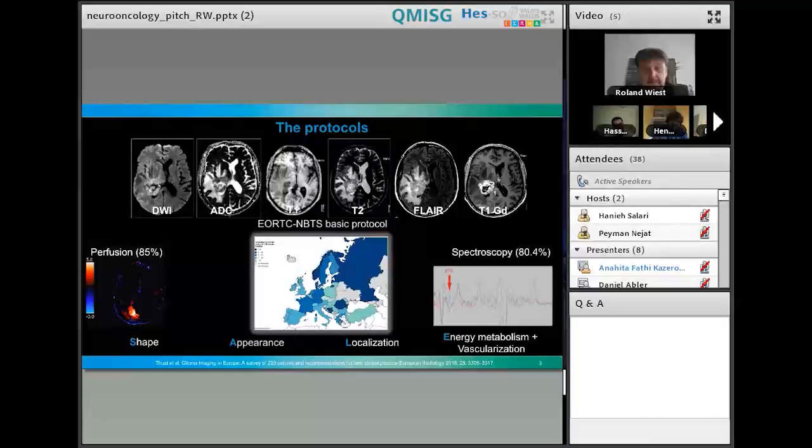And in the majority of the countries, also in Europe, these glioma protocols do not extend 60 or 30 minutes. Some of them are even short. In Switzerland, sometimes they're a bit longer. But I think the essentials, also for the added value that comes from perfusion imaging, and we will hear later about that, and that comes from MR spectroscopy. One of the most recent advantages is that we can quantify the status of mutated and of wild-type gliomas by detecting 2-hydroxyglutarate.